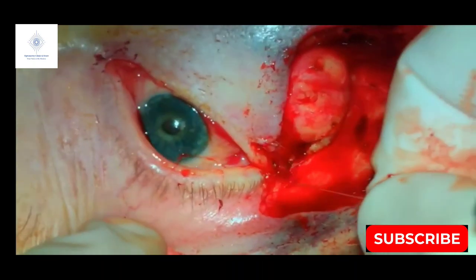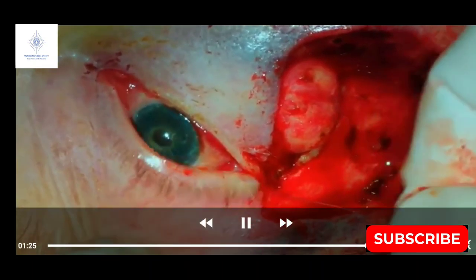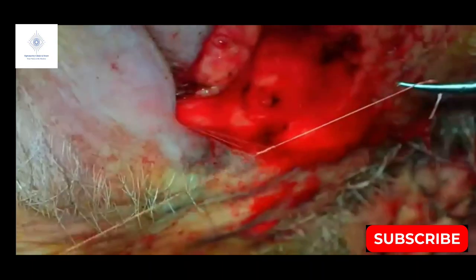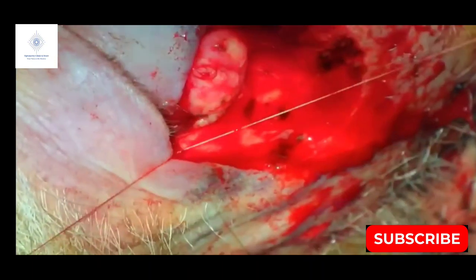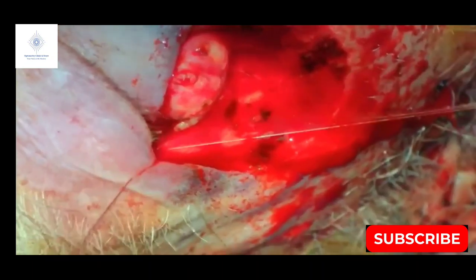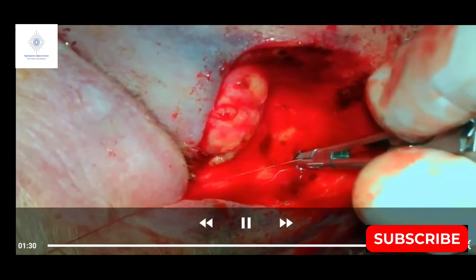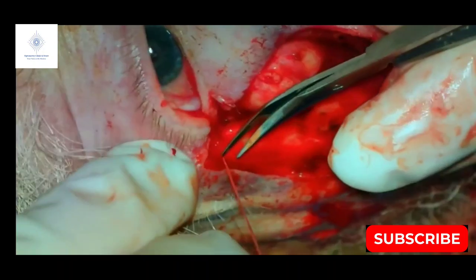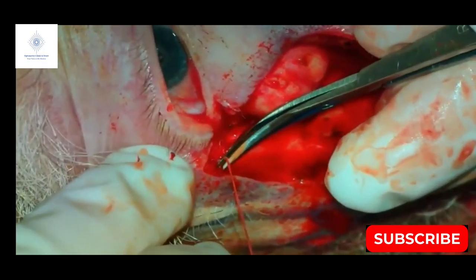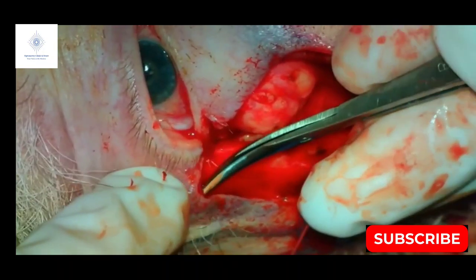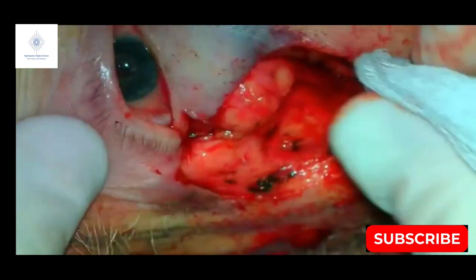This procedure is used in most lateral reconstructions including lower eyelid ectropion and retraction repair. The Mohs defect was then repaired with a Mustarde flap.